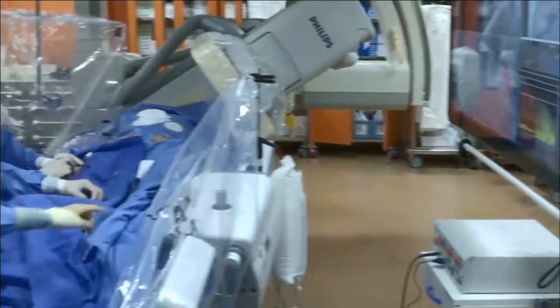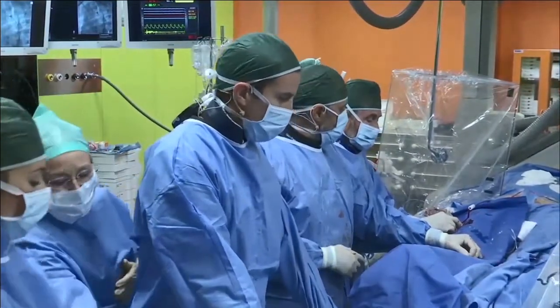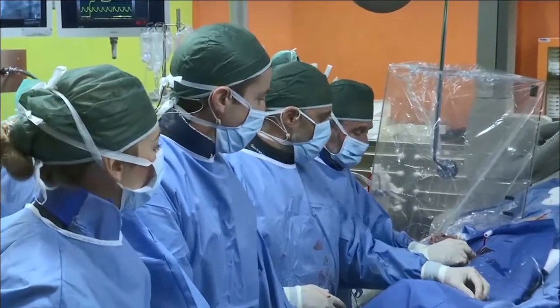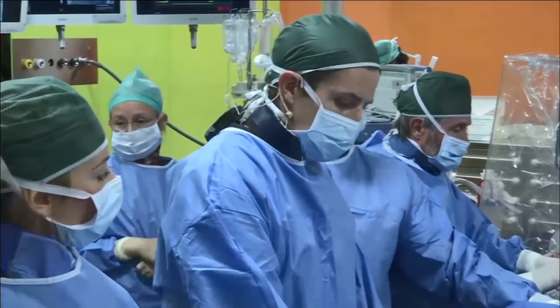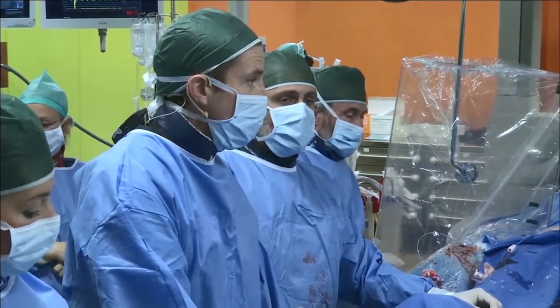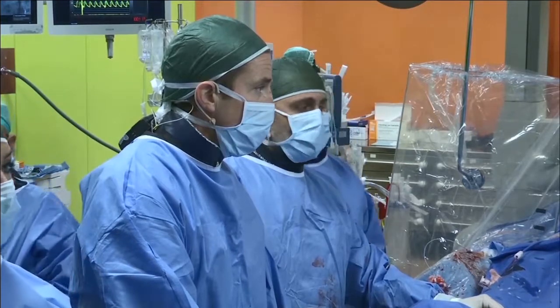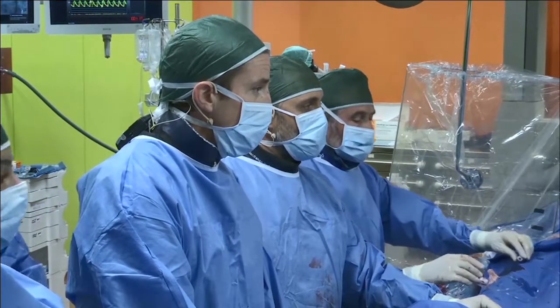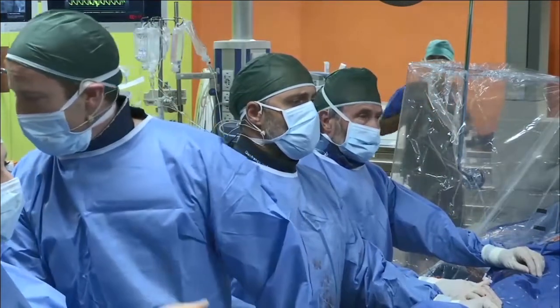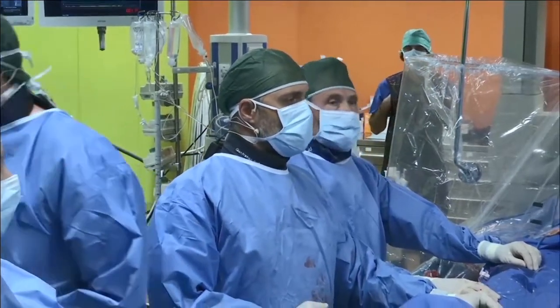Okay. So welcome back. We obtained the right femoral access. As usual, we perform that with the help of our vascular surgeon, Marta Kova. She's around. She did a good job. And we have put a 14 French introducer in that artery. We also obtained the right radial artery through a 5 French Terumo introducer, and we obtained the hemodynamics, and we do have a 40 millimeter gradient between upper part of the body and lower part of the body.